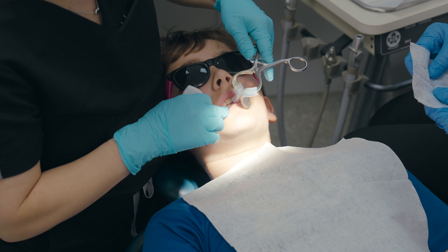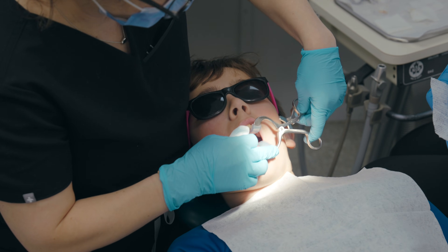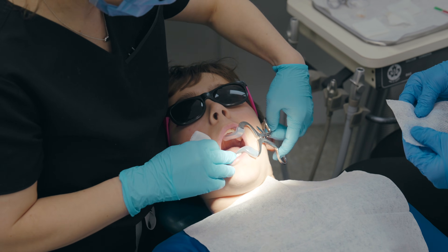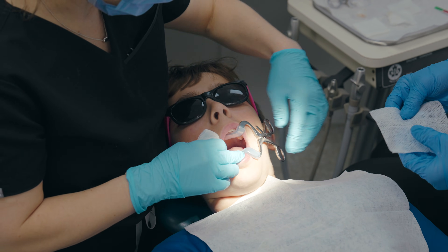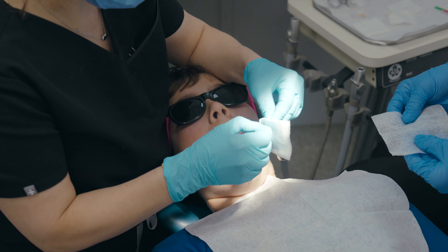For the extraction, the mouth prop is reinserted. A loose gauze is placed on the tongue as a pharyngeal guard in case the tooth is dislodged into the oral cavity during the extraction.